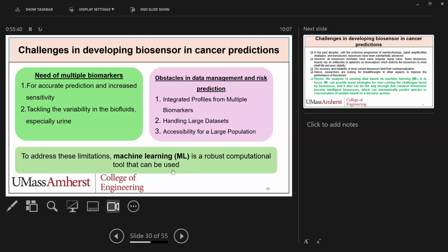So here our main hero comes into play. Like you all, we need the help of a machine learning expert to help us with this analysis. Humanly, it's impossible to analyze; how many Origin graphs will I sit and plot?